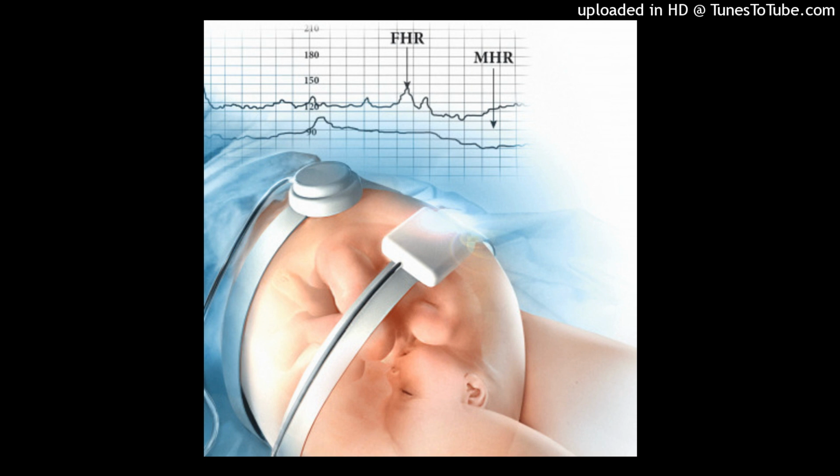Accelerations often occur with fetal movement, but also may be elicited with vibroacoustic stimulation, uterine contractions, or fetal scalp stimulation during a vaginal examination. Scalp stimulation is used to evaluate fetal response to gentle tactile stimulation through a dilated cervix when an indeterminate FHR tracing is observed.